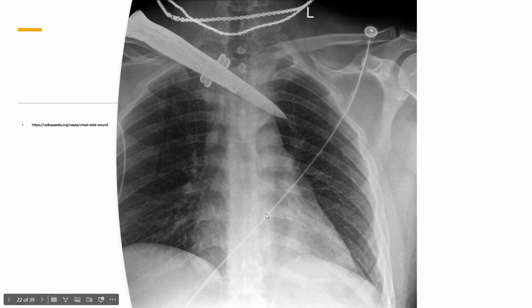They have a couple of tubing artifacts. This is probably part of an EKG clip on either side. These are metal. They have their necklace still on, which is metal, and of course that pesky knife going through their chest, which is also metal. On either side here we also have their diaphragms, which appear a little bit more radiopaque, but more so because there are a lot of overlapping structures here from the bone and from the organs that are sitting right underneath them.